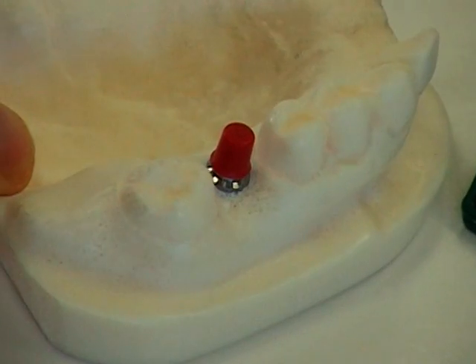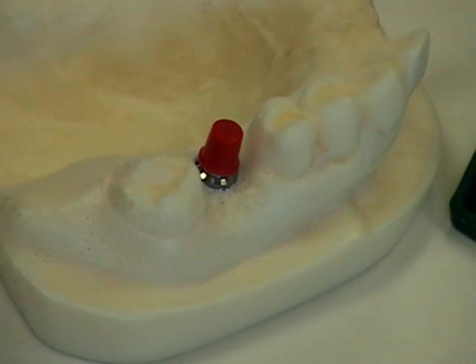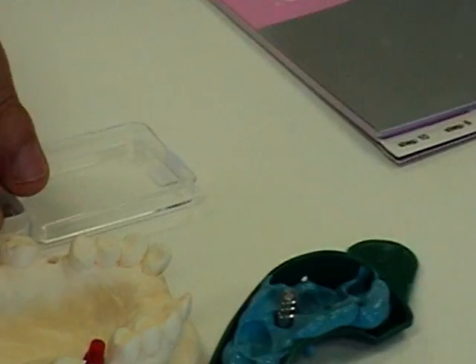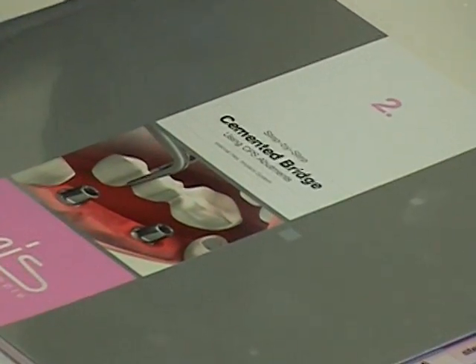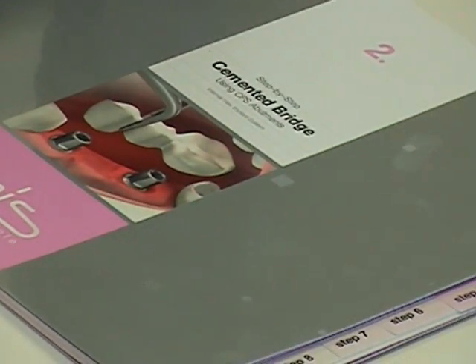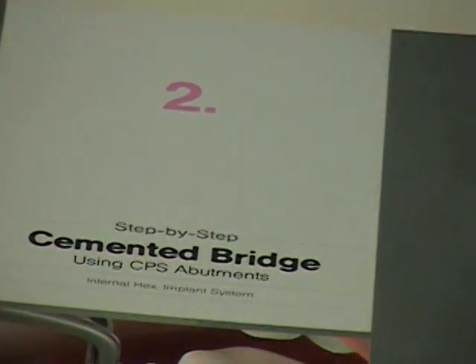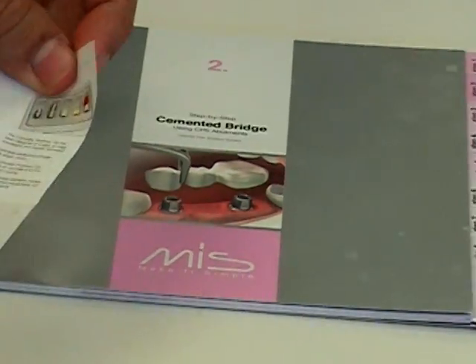The plastic can be trimmed away or added to, and then burned out after investing it, to create the final crown, which will then be sent back to the dentist, who has the patient come back in to place the final crown on top. All this information is shown inside the step-by-step brochure number two, as well as in the user manual, which is included in each prosthetic set.